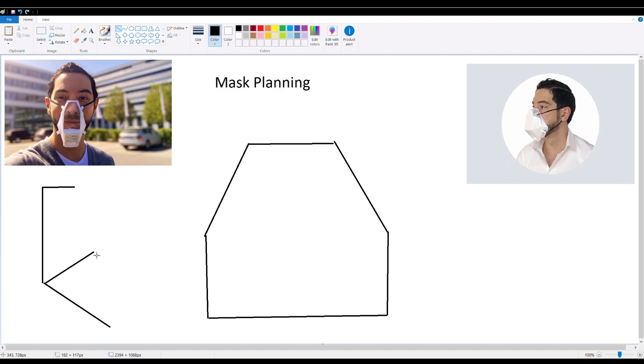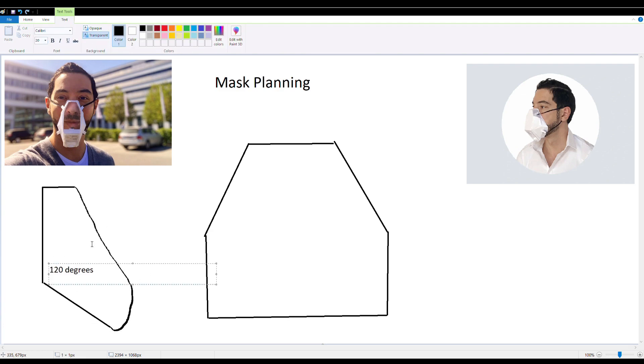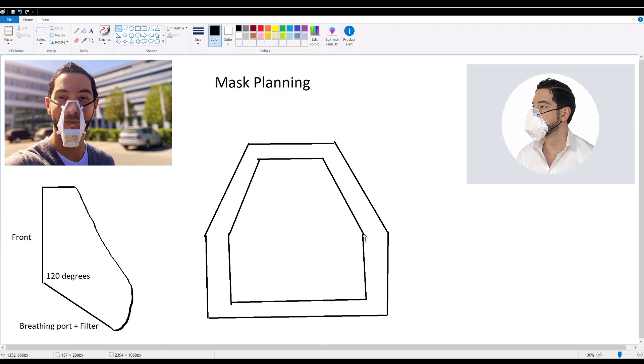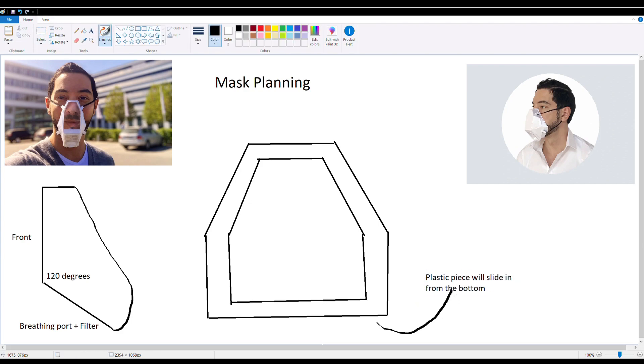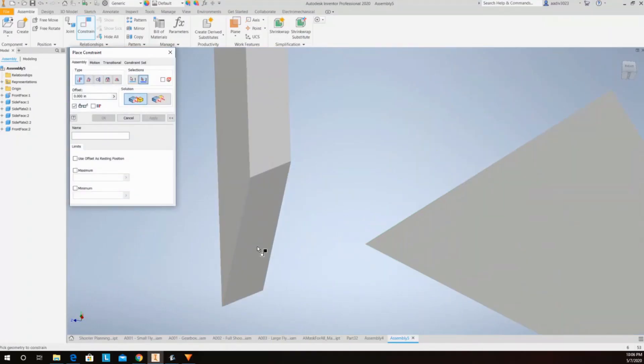And then on the left corner, that's like the side profile, it's at a 120 degree angle. You have the front and then the bottom side is going to be a breathing port plus the filter. And then the plastic piece for the transparency is going to slide in from the bottom and there are going to be loops all around the side for the belt slash strap.